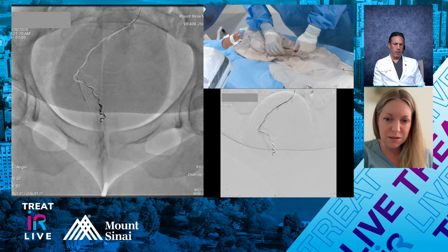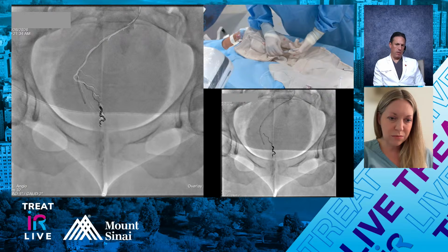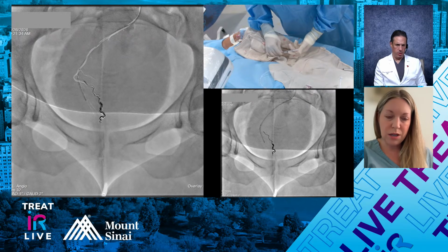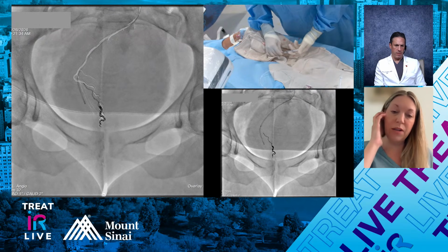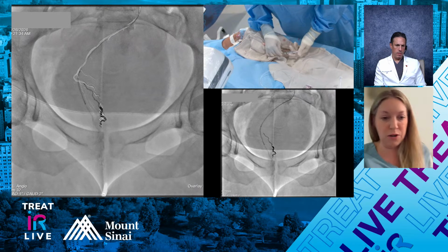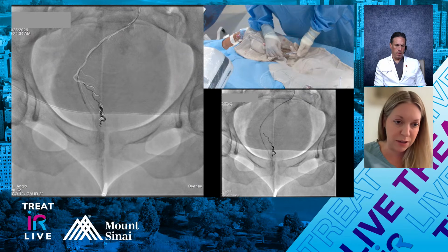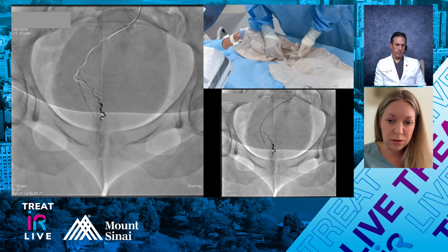Do we have any value of cannulating the middle rectal retrograde through the IMA circulation? Yeah, when we can, if it's got a proximal enough communication where you can retrograde get to it, then I've been doing it that way. So that's nice. Yeah, I think that's what I like about the particles a little bit.